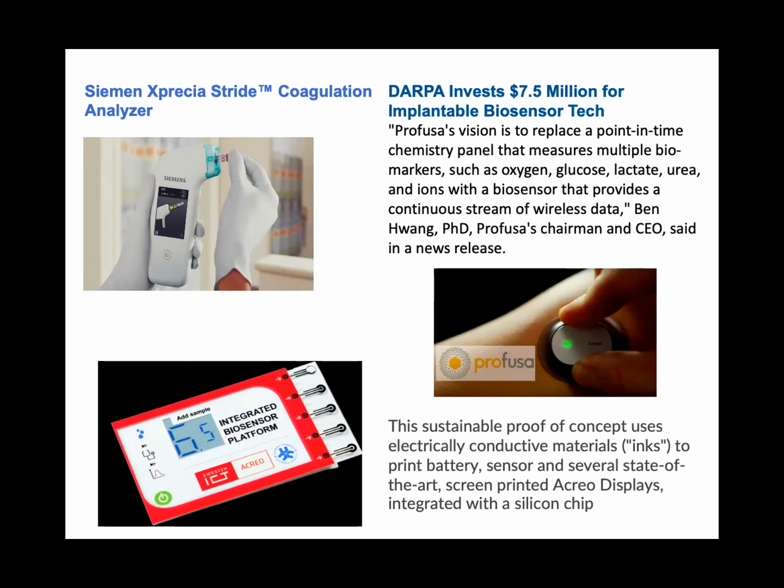And these machines are to detect what we call coagulation, because some people have problems of blood clots. Their blood keeps clotting, so they have to check their blood clots from time to time. So this is an example of electrochemistry being used.